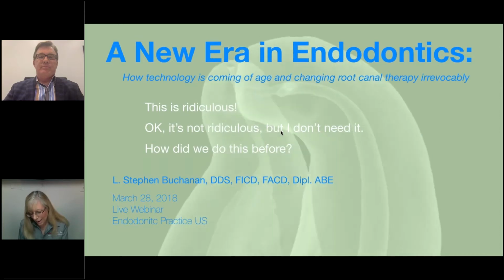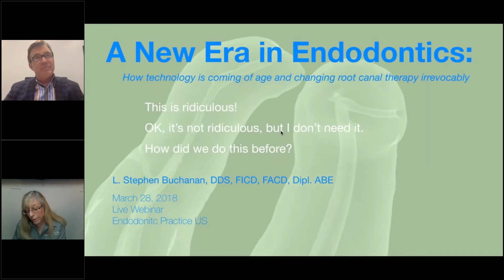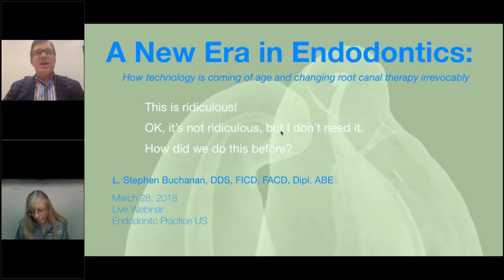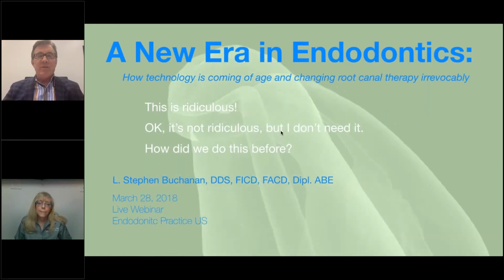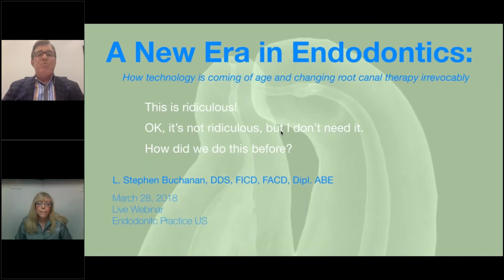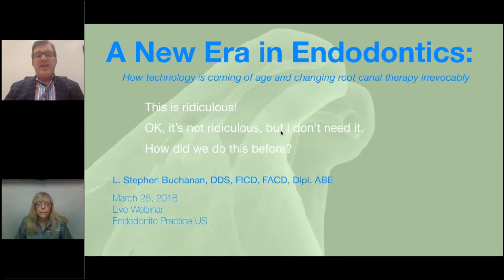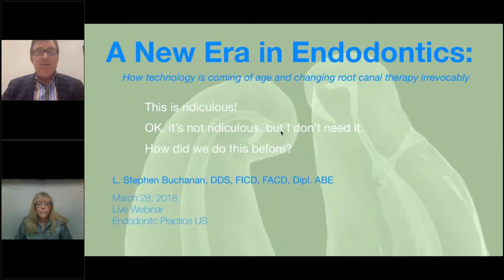Okay. Is the primary value with 3D microscopes improved ergonomics, better field of vision, or both? Oh, both. The reason that microscopes haven't been popular in general dentistry is because they require a wider range of position of the magnification device. With endo, we're looking through little tiny access openings, so we can have a limited range of motion, and it still works. And the evidence of that is every endodontist in the world has at least 2 microscopes.